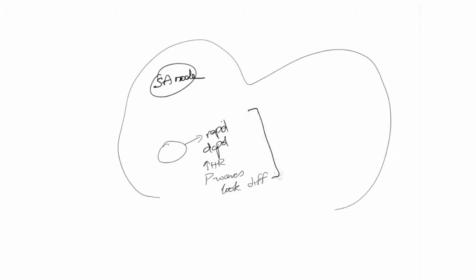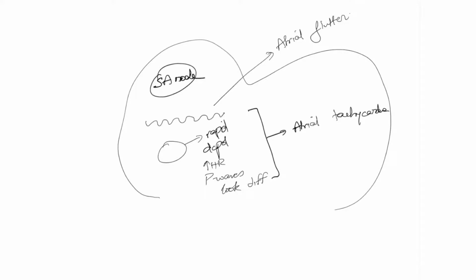And this can cause something called atrial tachycardia. Now, sometimes there could be a re-entry circuit established within the atrium, and so you would see a faster beating heart rate that causes a characteristic wave pattern, and this would be atrial flutter. And whenever there are these faster beating heart rhythms, tachyarrhythmias, there might be an underlying heart block.